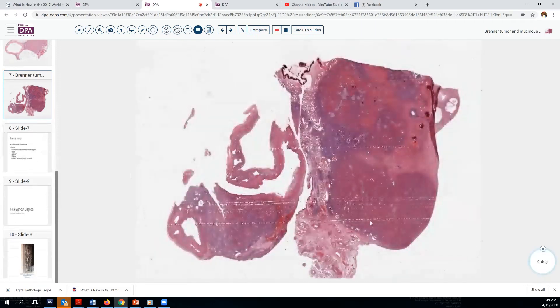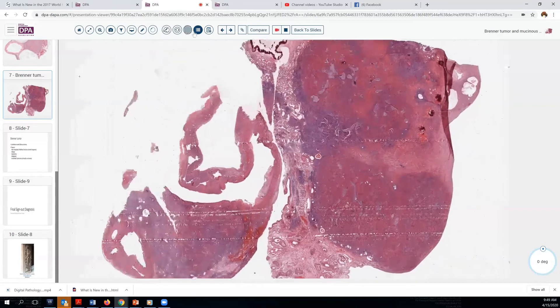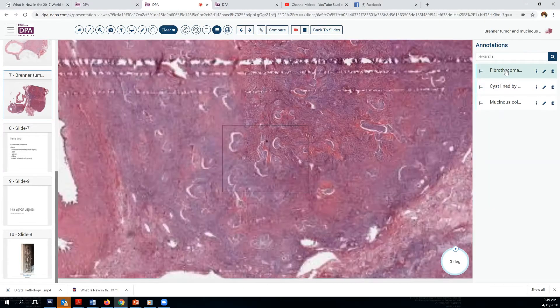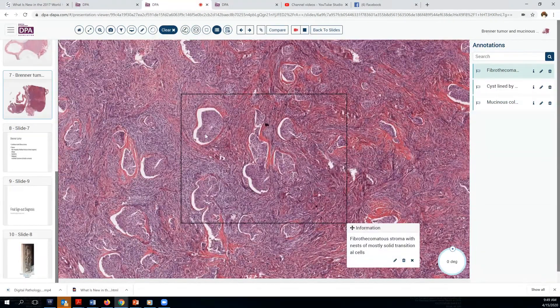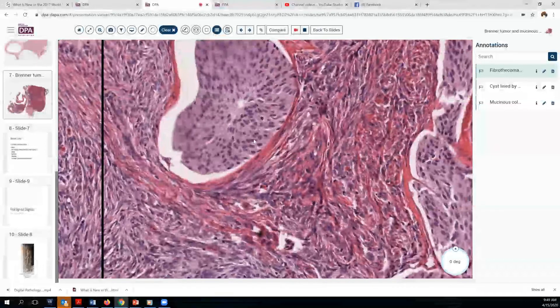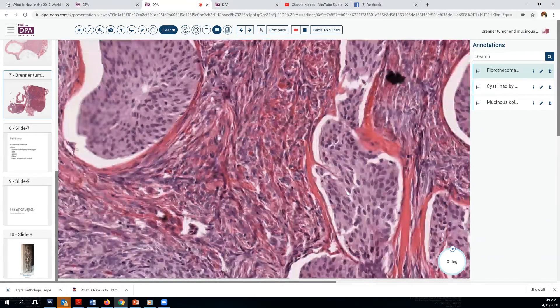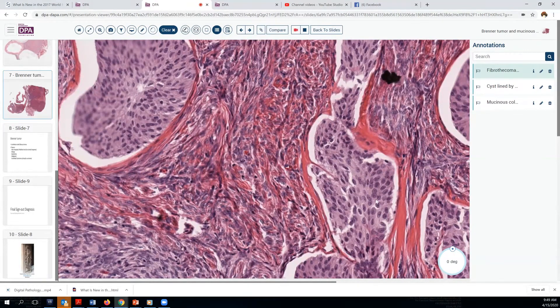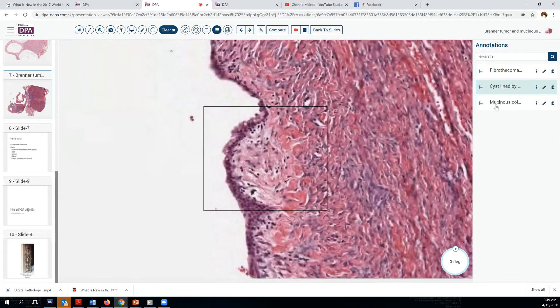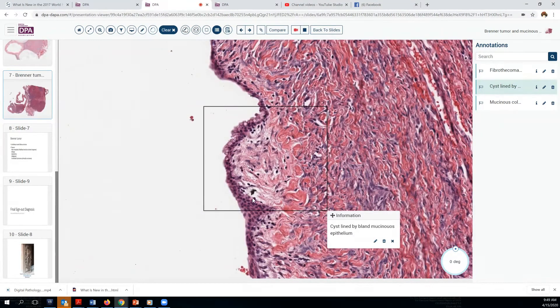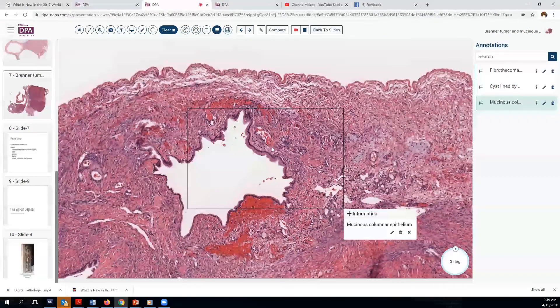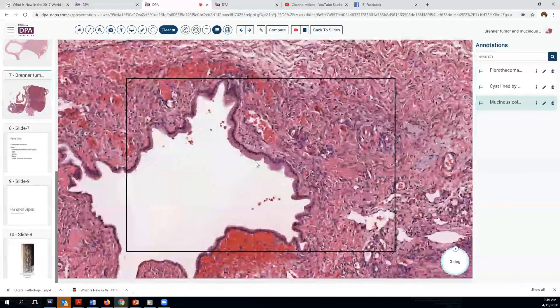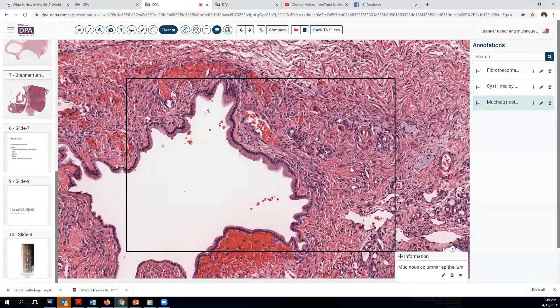Looking at another case, we find another variation on this lesion. We can see this fibro-thecomatous stroma and solid nests of cells. Again, you can see very bland nuclei, occasional chromocenters, and maybe a groove or two. We also have a cyst adjacent here, but rather than squamous, we see that this epithelium has a very bland, slightly mucinous character. Here's another area where we have a mucinous epithelium associated with this lesion — and this is a common finding in Brenner tumors of the ovary.